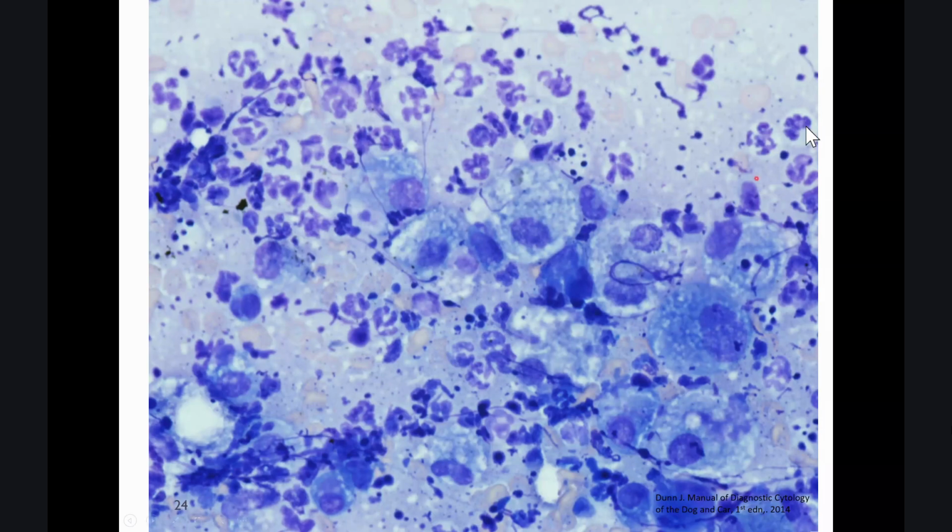What's going on there? Okay, from this one, I'm gonna say there is inflammation there. But this is the big one, but mostly it's still inflammation. So we know it's still inflammation. The big one is supposed to be the macrophages, because macrophages usually can be big, can be round, can be oval. It depends.